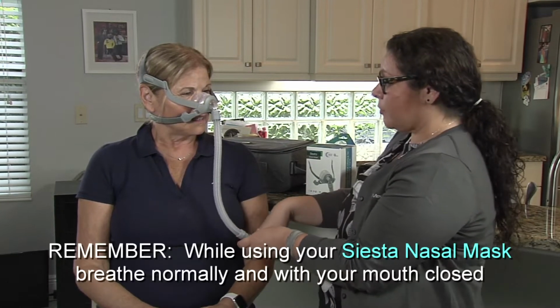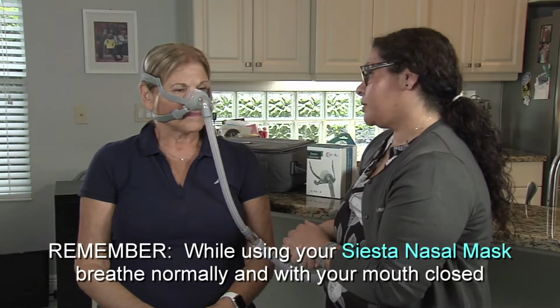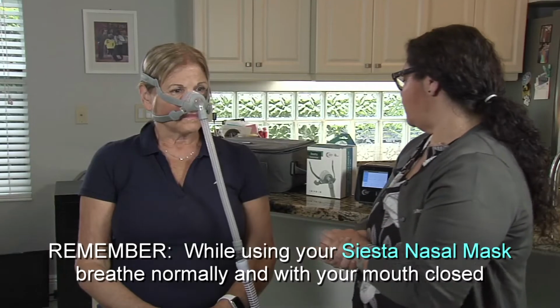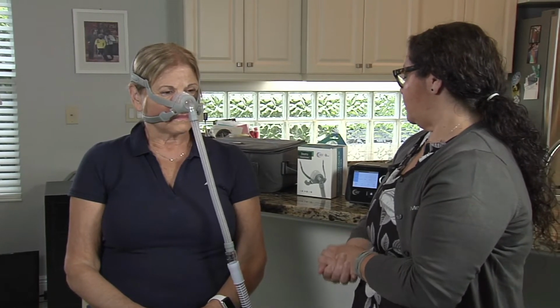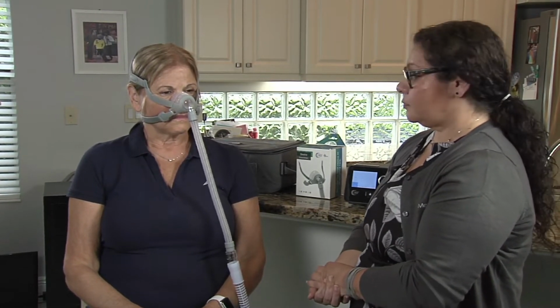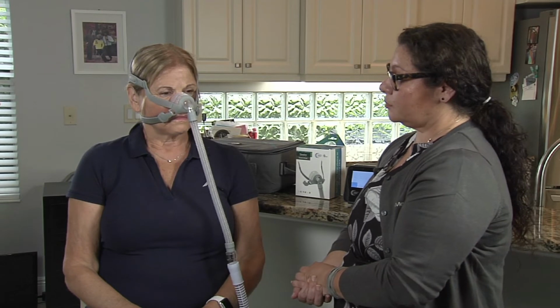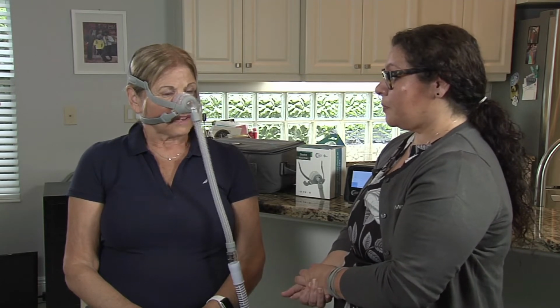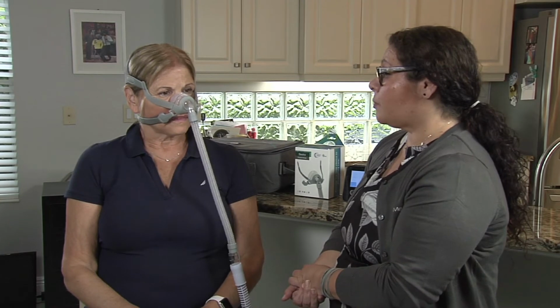Just remember to breathe normally and try to breathe with your mouth closed. How does that feel? Feels comfortable. Do you think you can recreate putting on the mask yourself? I could try. Perfect.